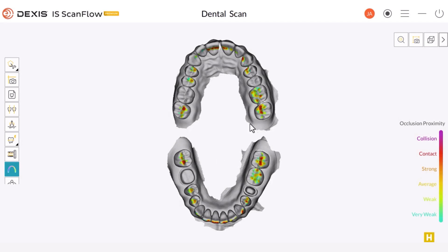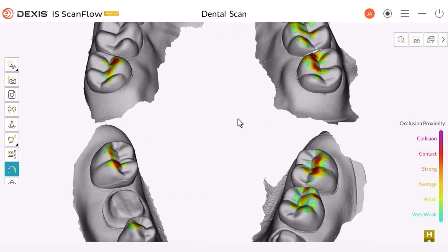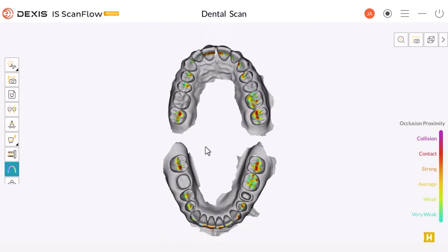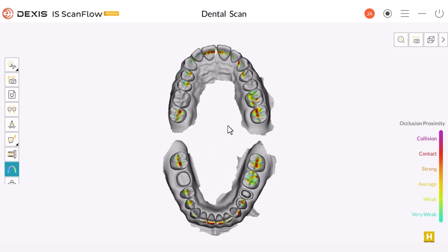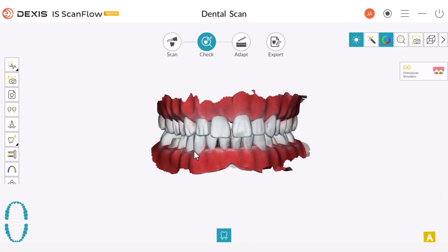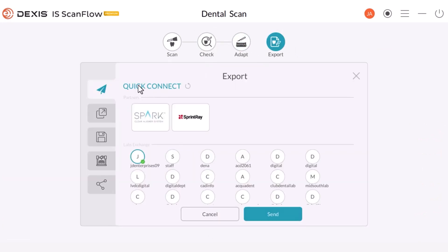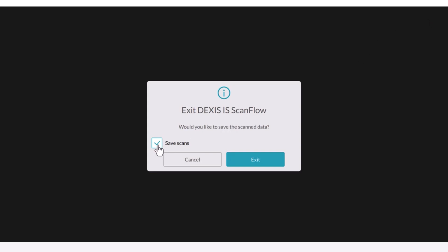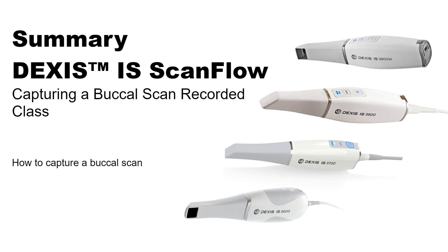The color legend indicates where the bite is in contact. If you notice purple areas, it signifies over-occlusion or possible incorrect intersection of bites. In such cases, go back, locate the incorrect bite, and delete it if necessary. This tool provides a reliable confirmation of your scan quality beyond visual inspection. If everything appears satisfactory, you can proceed by either selecting the Export button to explore export options for your scan, or by choosing the Close button to save the case and export it later. This concludes the DEXIS Intraoral Scanner capturing a buccal scan recorded class.